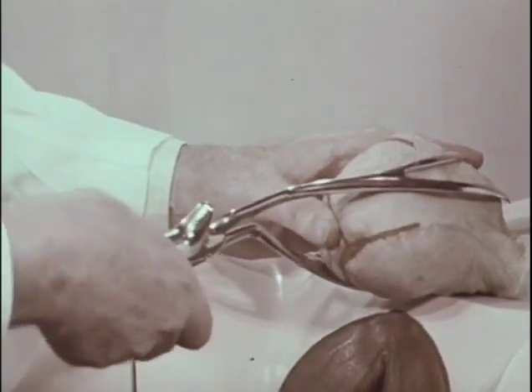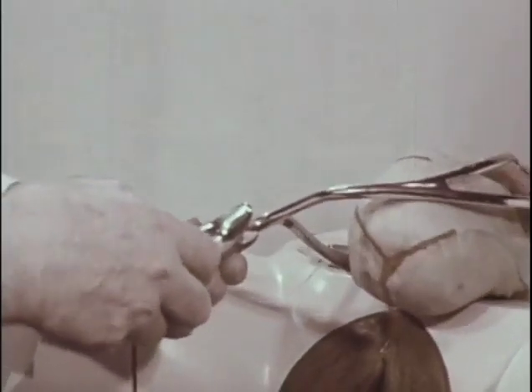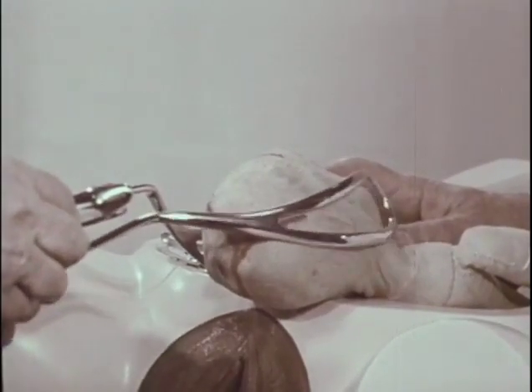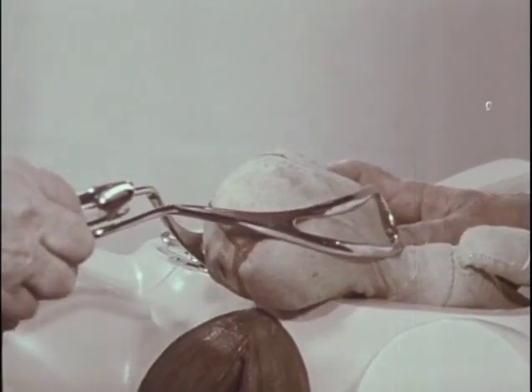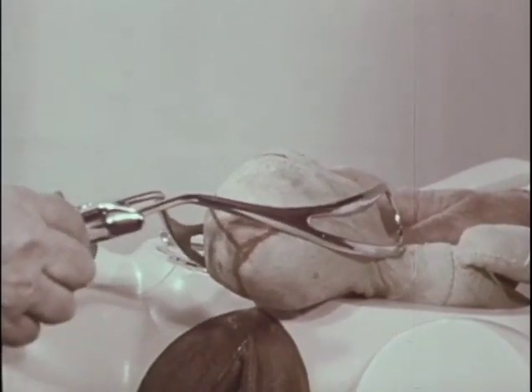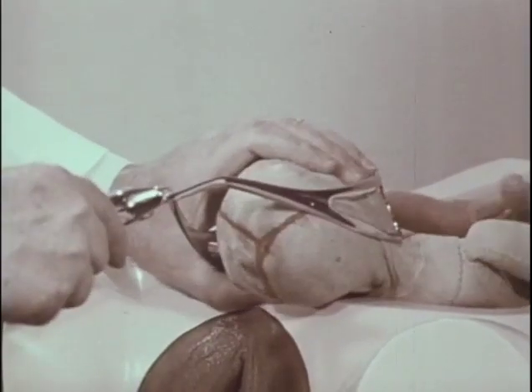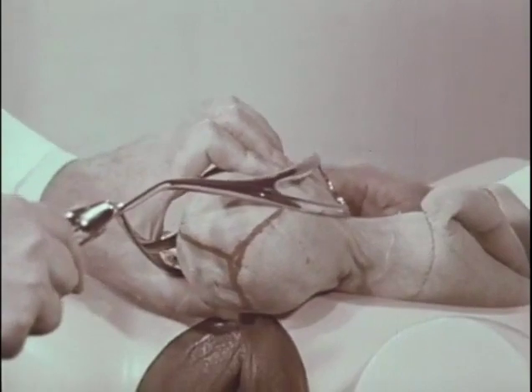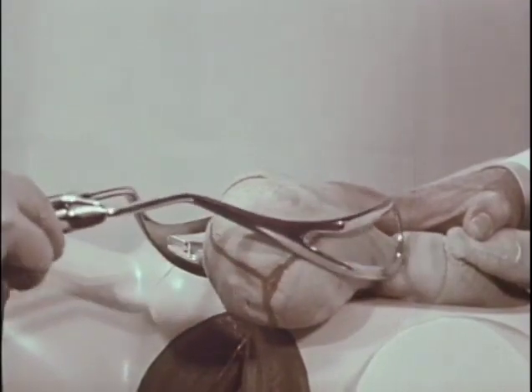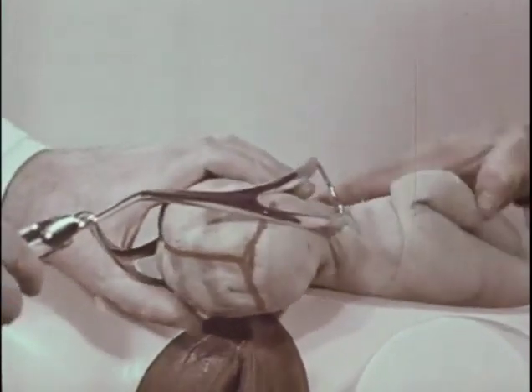Then the forceps are readjusted one at a time to get a brow mastoid application. The left blade is carried backward towards the mastoid region, and the right blade is carried forward towards the frontal region. Lift up, rotate, pull down. Then readjust again, one at a time, a little further, more of a brow mastoid application. Push up, rotate, pull down.